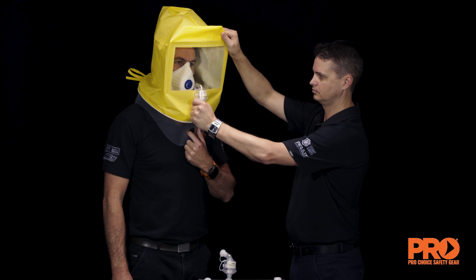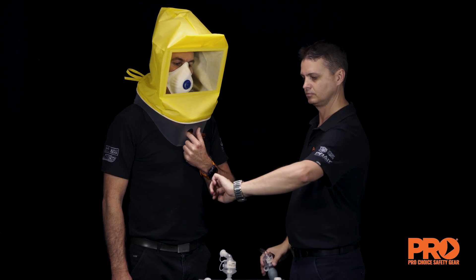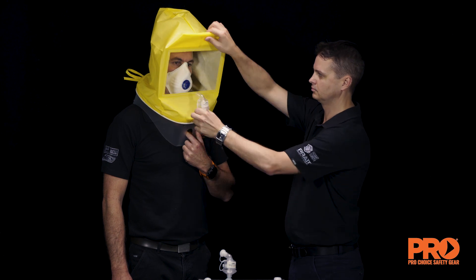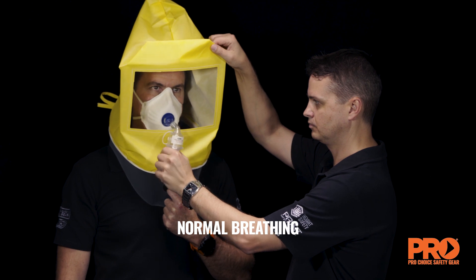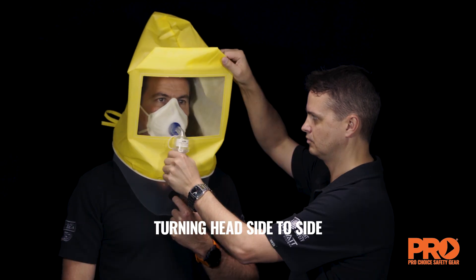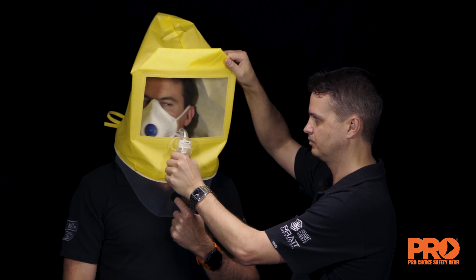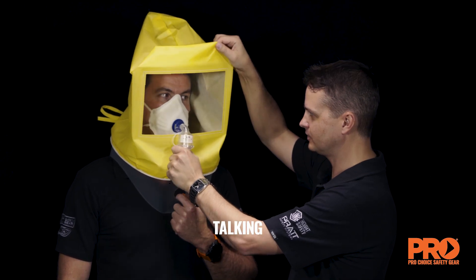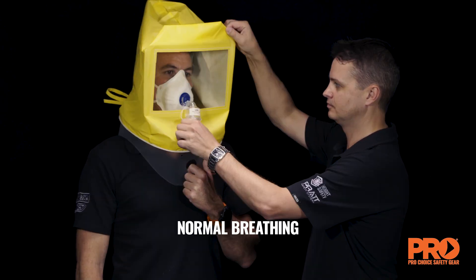After the initial injection of aerosol, the test subject will perform each of the following test exercises for 60 seconds while injecting the required number of squeezes: normal breathing, deep breathing, turning head side to side, moving head up and down, talking, bending over, and normal breathing again.